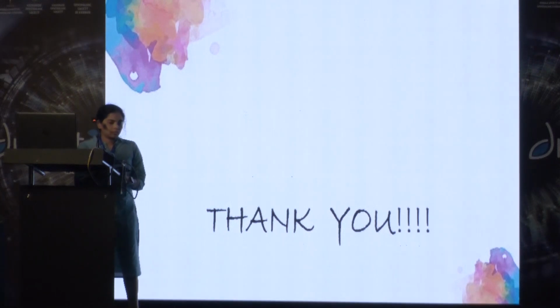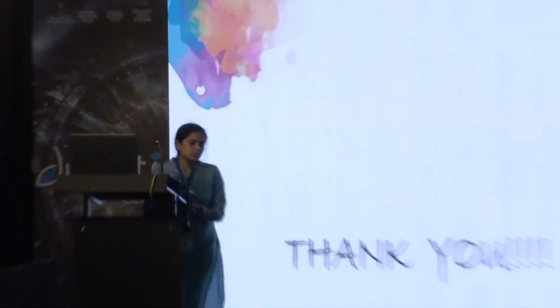Yeah, nice study. I just want to ask a few things for clarification. So how do you think this OCT RNFL analysis is going to help you in diagnosing NAION more than the clinical findings? Sir, I included patients with obvious findings like RAPD and sudden onset visual loss. But in case of subtle edema and all, we can employ this OCT imaging and by measuring the RNFL thickness, if there is an obvious RNFL thinning or GCIPL thinning, that can help in diagnosis. I only included patients with such obvious findings.